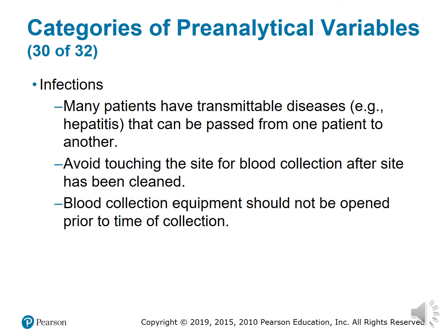Infections. Many patients have transmittable diseases that can be passed from one patient to another. Avoid touching the site of blood collection after the site has been cleaned. Blood collection equipment should not be opened prior to the time of collection. This is why it's important, and imperative. I've spent so much time trying to encourage you all to make sure that you know the steps for performing venipuncture properly. I've spent so much time on infection control. I've shared with you all that infection control is a great part of your certification. We have to make sure we know these things. We have to make sure that we're performing the venipuncture steps in the proper order to prevent these types of things from happening.